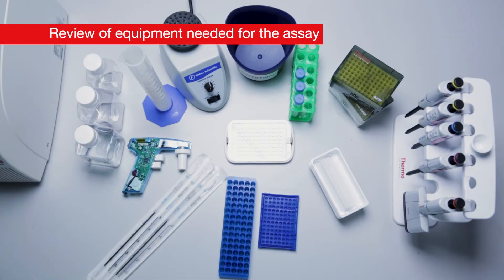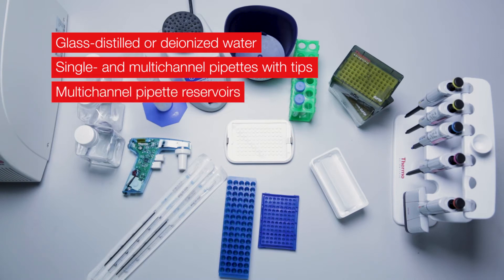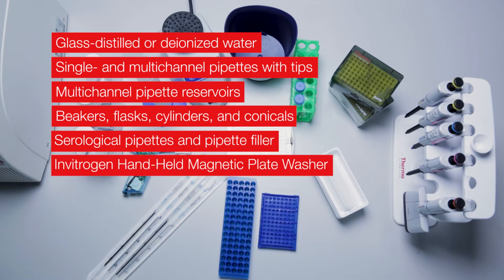To perform the assay, you will also need glass distilled or deionized water, single and multi-channel pipettes with tips, multi-channel pipette reservoirs, beakers, flasks, cylinders, and conicals, serological pipettes and a pipette filler, and an Invitrogen handheld magnetic plate washer.